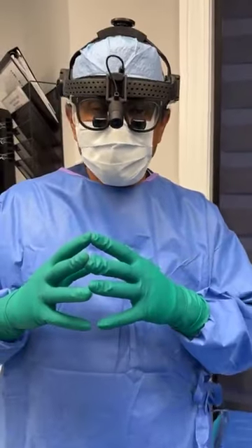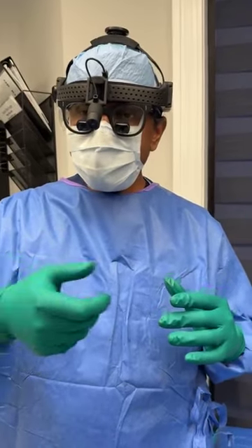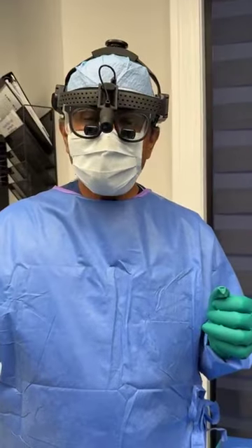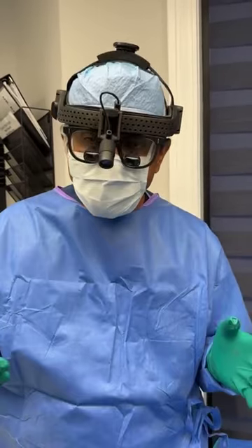And she interestingly had her explant done under local. That means she was not even put to sleep. The surgeon gave local and then made a cut, and literally while the patient was fully awake, just like you're at the dentist, pulled the implant out, and the capsule was indeed very much remaining behind. So the goal today was to remove the residual capsule below the muscle.